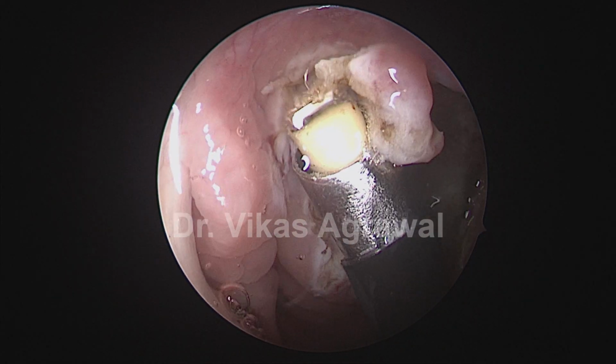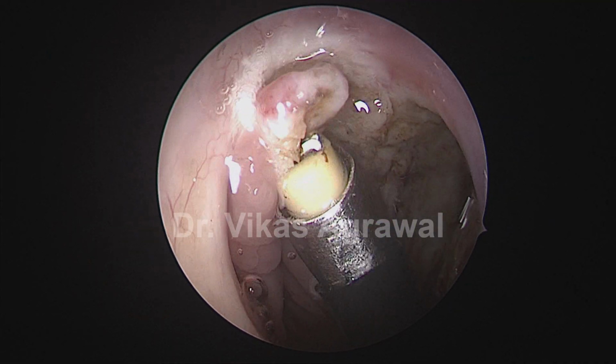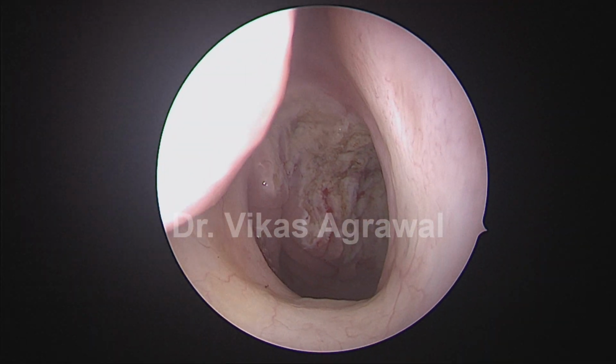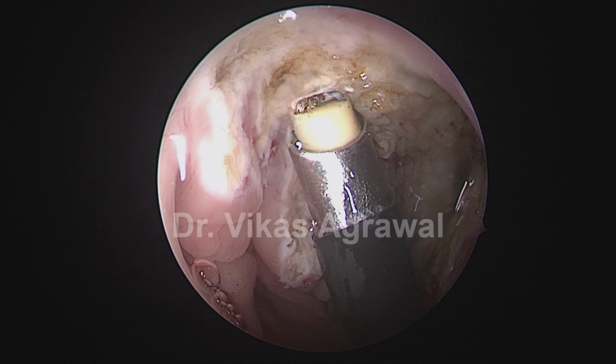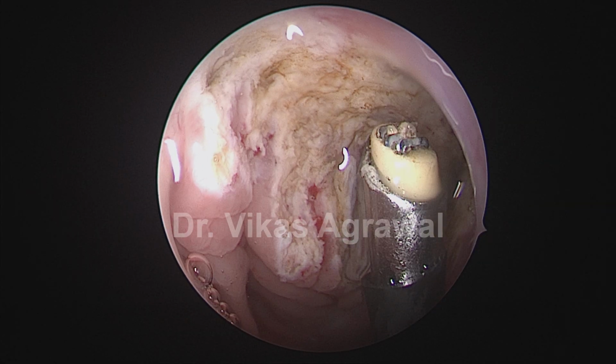Again, I'll start from the superior boundary. Superior boundary is the periosteum below the sphenoid bone. Alright, let me remove this tissue. Periosteum below the sphenoid bone, and will completely clear up the superior boundary.